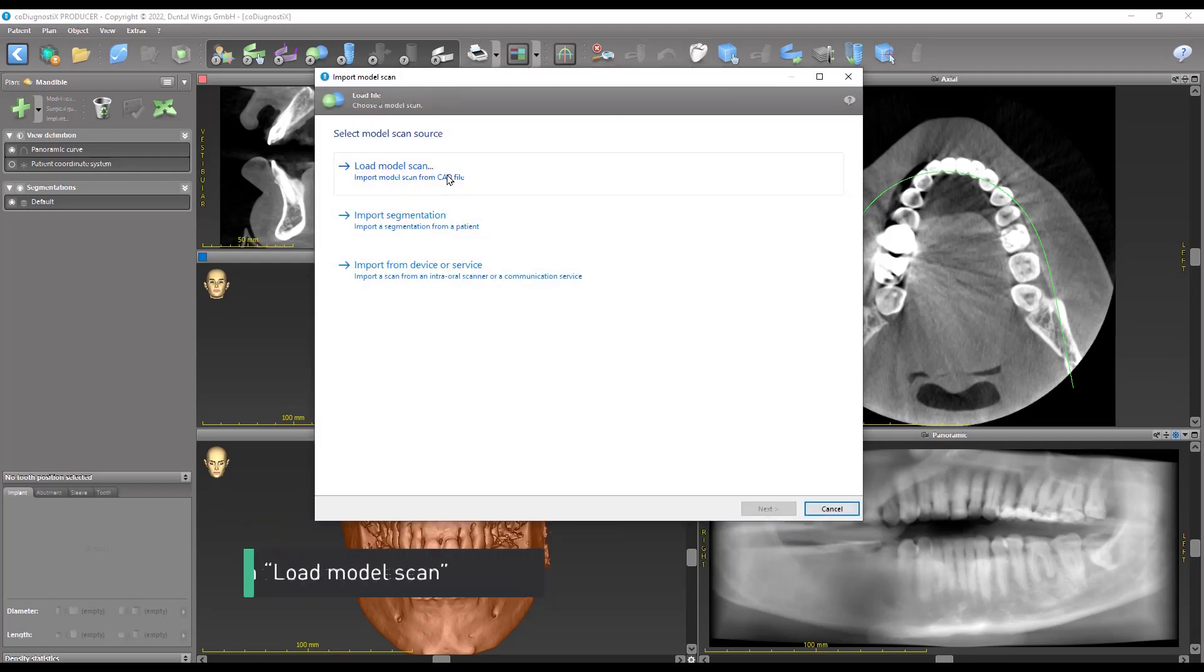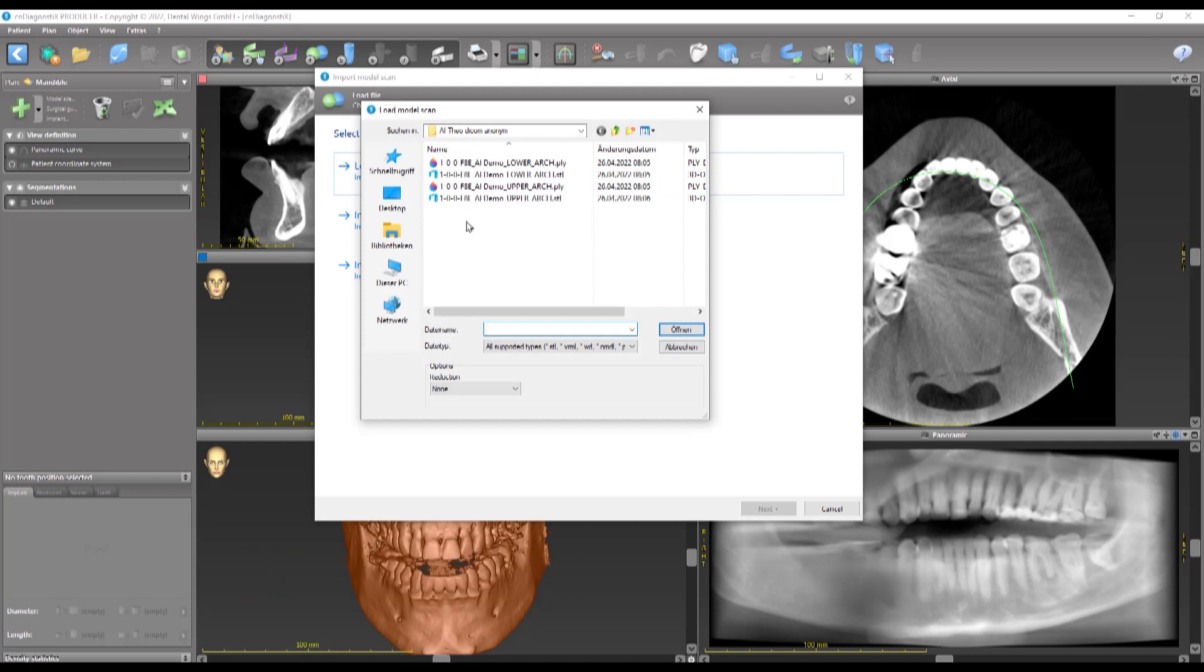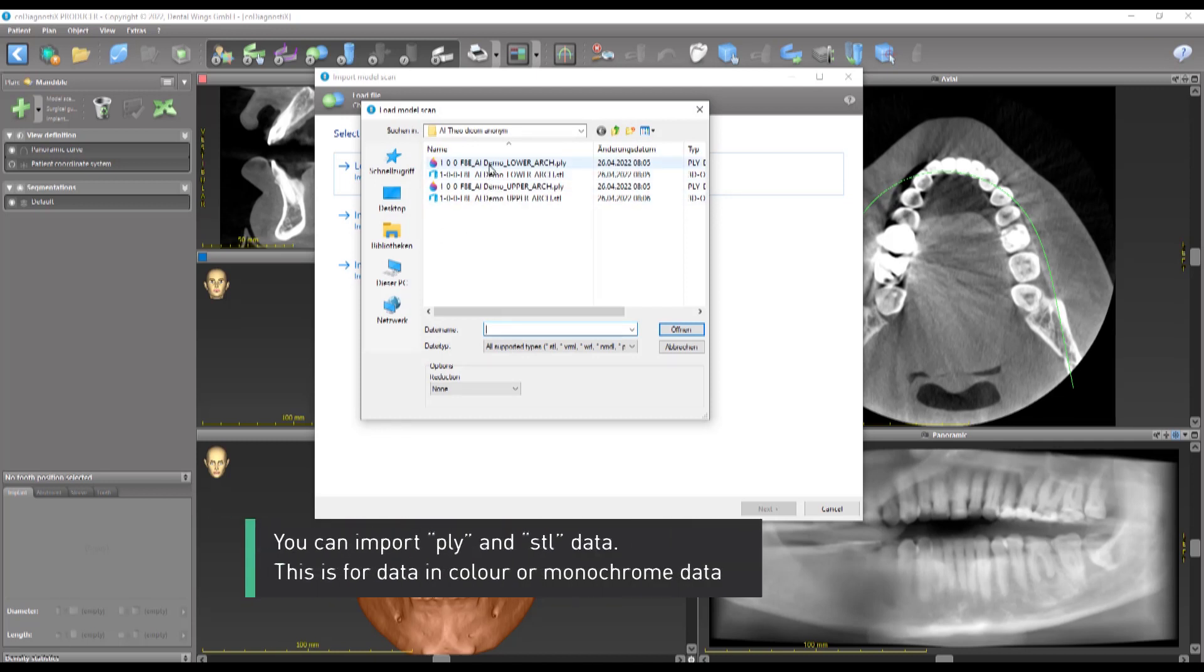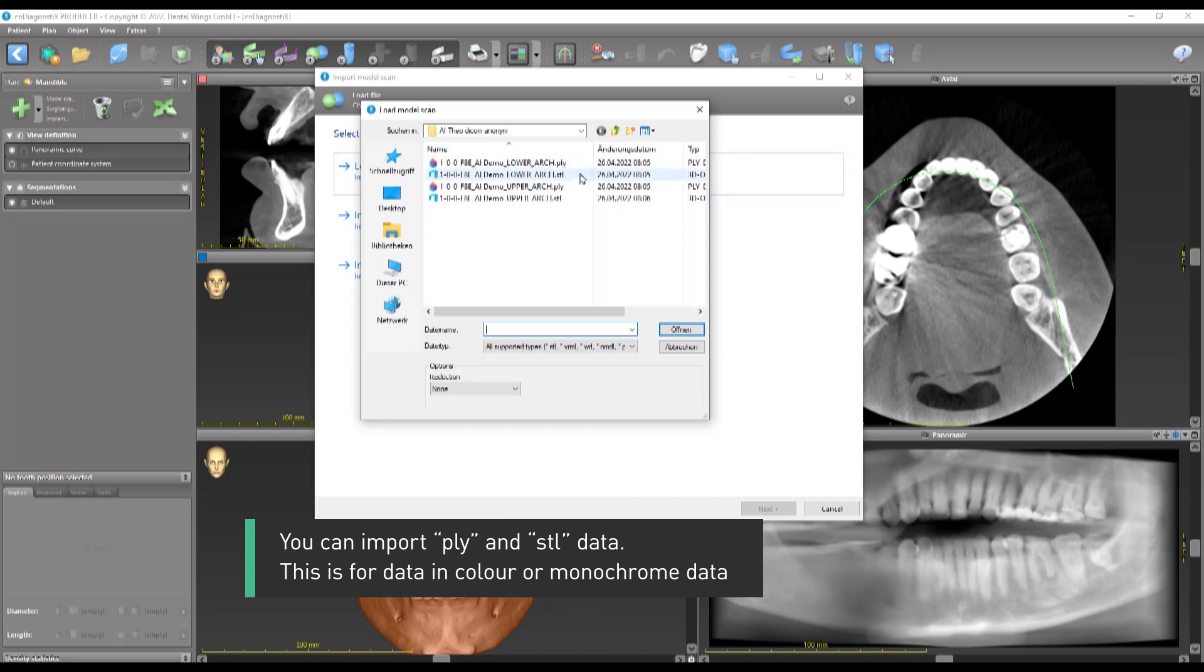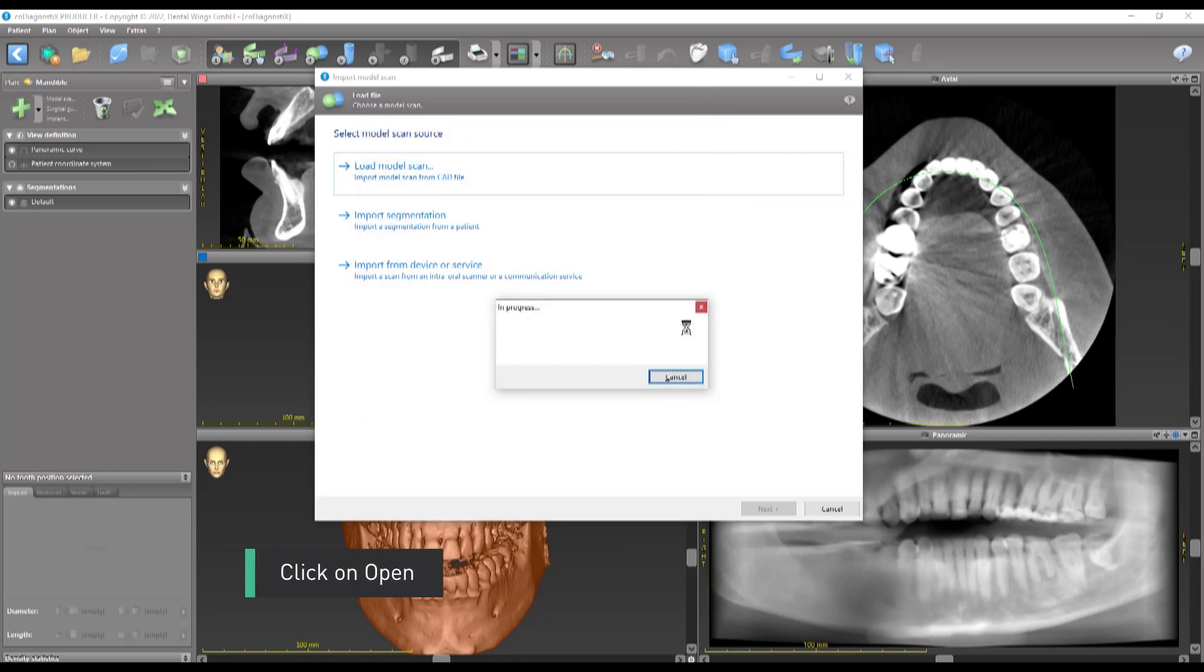Click on Load Model Scan. Let's choose the lower scan. You can import PLY and STL data. This is for data in color or monochrome data. Click on Open.